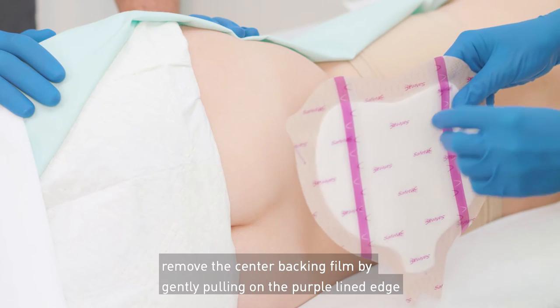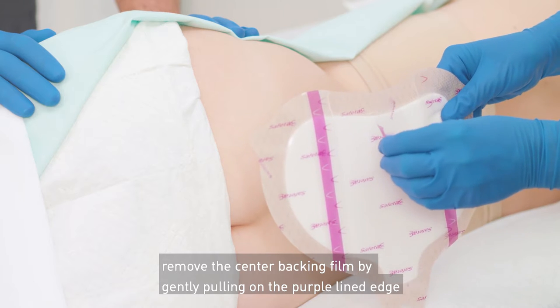After skin is prepared, remove the center backing film by gently pulling on the purple lined edge.